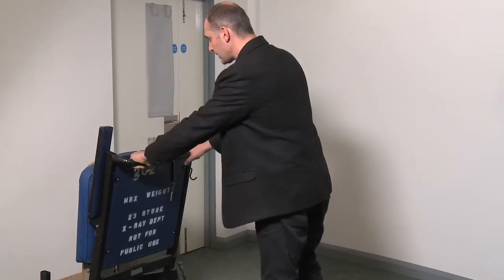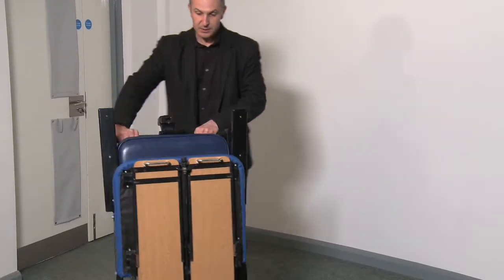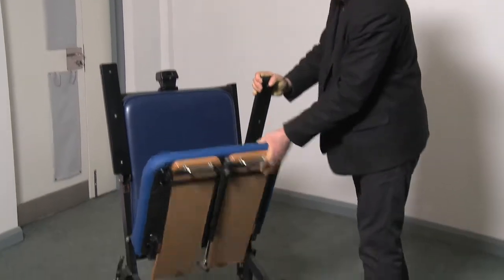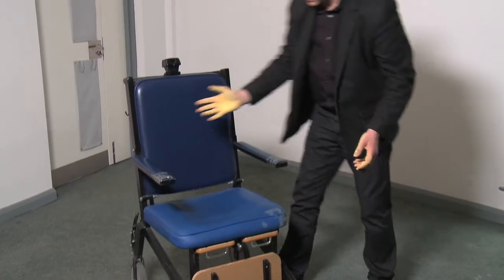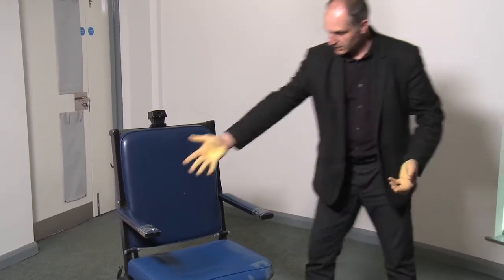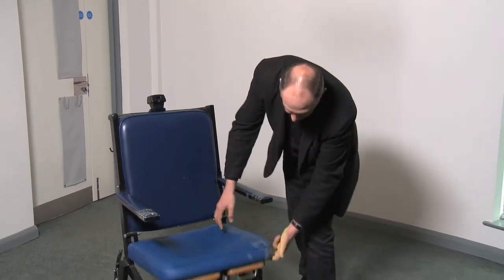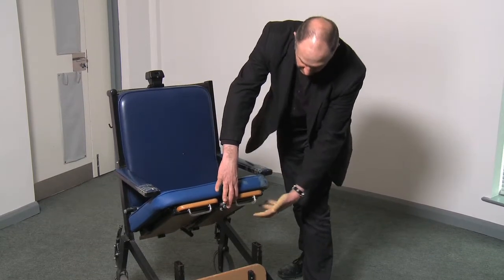One of the most informative tests we did was to have people act as patients and porters and put coloured chalk on their hands so we can actually see for ourselves where the chairs were being touched. And you can immediately see that not only have I touched the handlebars, but I've touched the armrests right underneath, and also in this case the seat and underneath there as well. And all of those joints are dirt traps.